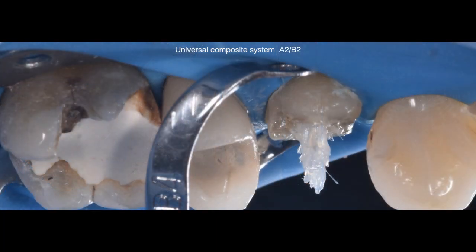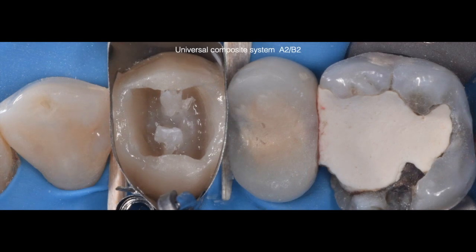Here is a lateral view of the fibers. Using this wax-up we created buccal and lingual matrices to help us achieve ideal dental anatomy of these walls. Here you can see both buccal and lingual walls completed, followed by the placement of a matrix band and wedges to restore the proximal walls.